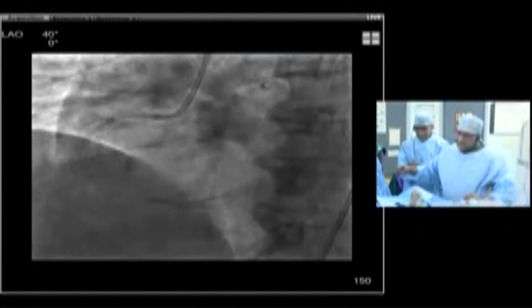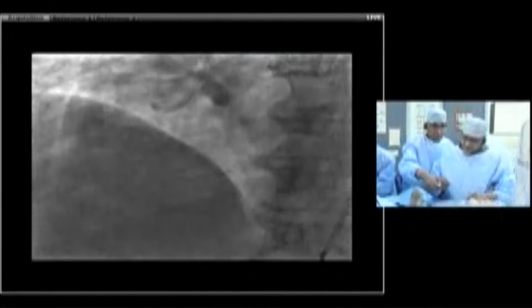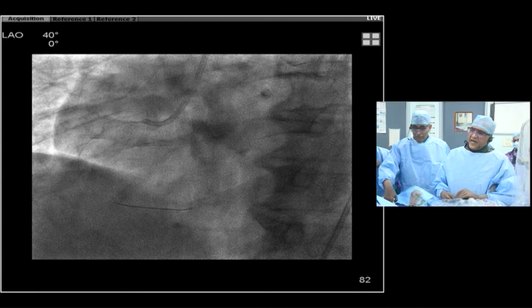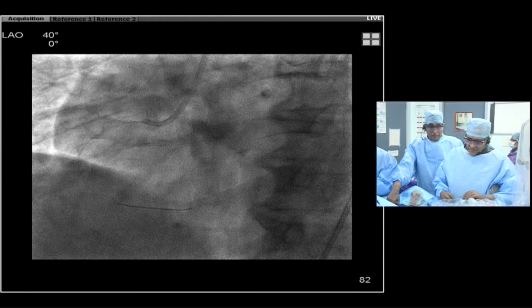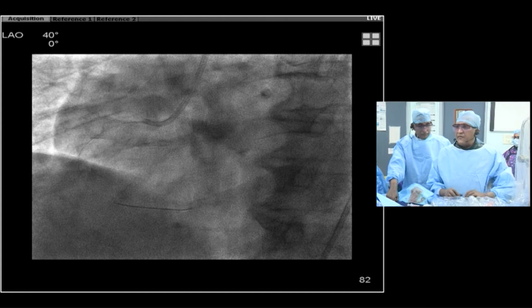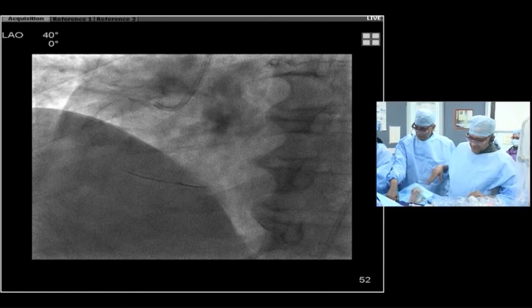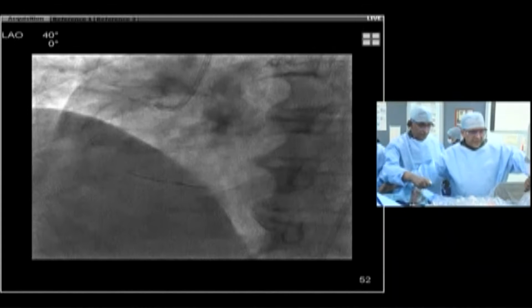What I do is, if I have an uncrossable lesion at this stage, I will use rotational atherectomy because it's more cost effective for me, and it is very likely to make everything work after that without using highly expensive technology. I fully agree. We've already used the laser to demonstrate it. In my routine cases, if the balloon didn't cross, I have to get a rota wire. Yeah, it's an indication for rotational atherectomy. Makes total sense. So give me a microcatheter, please, and give me a pacing wire.